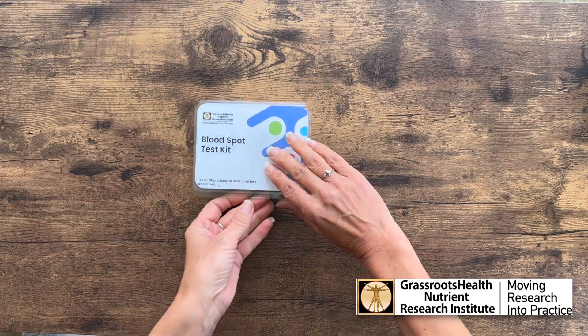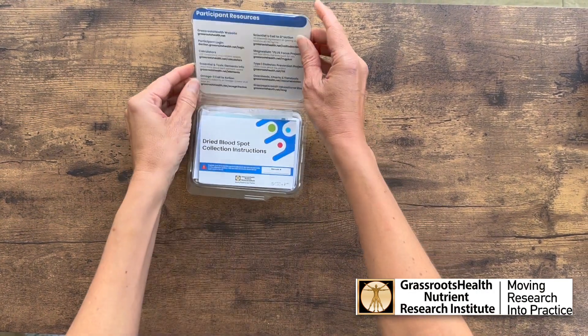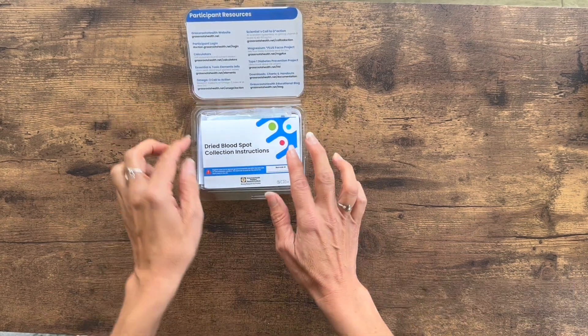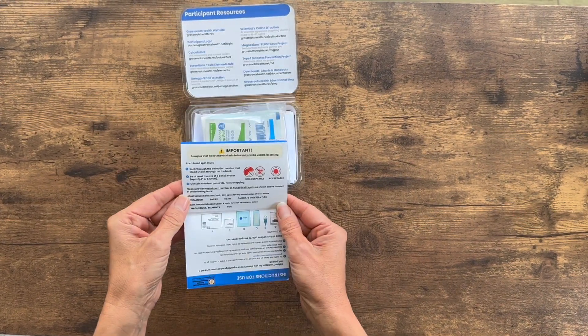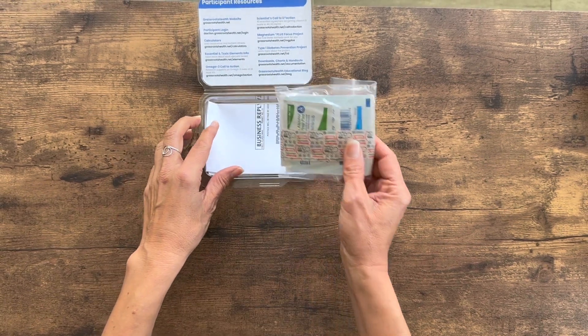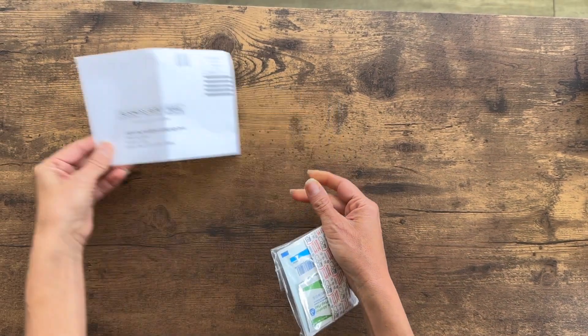Now that you have received your blood spot test kit from Grassroots Health, open the kit, read through the instructions, make note of what a good blood spot sample looks like, and place all the contents out on a flat surface.